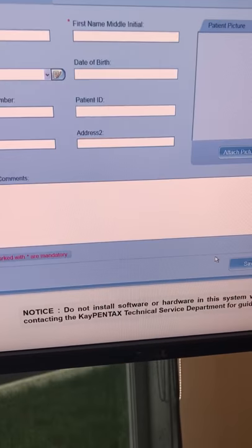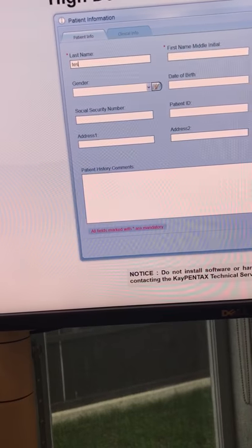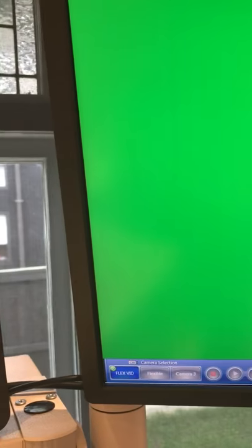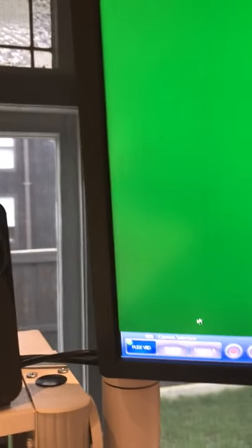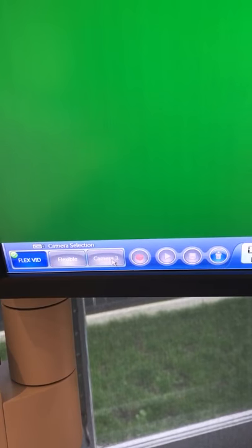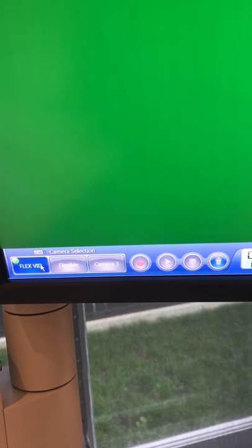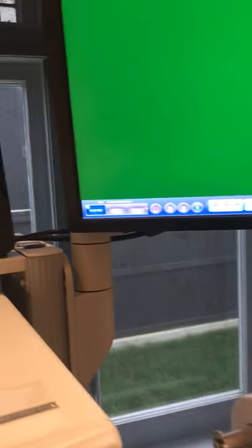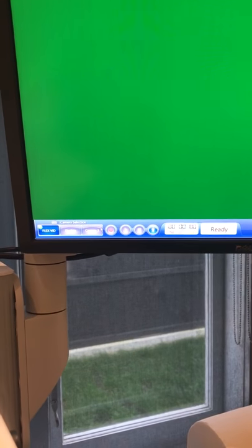So let's say new patient — last name, I'll put 'test'. Save. I can't record because I don't have the processor turned on. Down the bottom here: flex video. We can program these — we can put rigid scope. You've got three camera sources that can be connected in here. Sometimes you might have two video scopes like a Pentax and an Olympus — you can have a Pentax processor, Olympus processor, and a separate rigid scope processor. You can record from there, or from down the bottom — you've got the halogen, the strobe, and the record button. So I thought that would just be a really brief little overview of the KPentax stroboscopy system, the 9-310HD and 9-400 strobe.